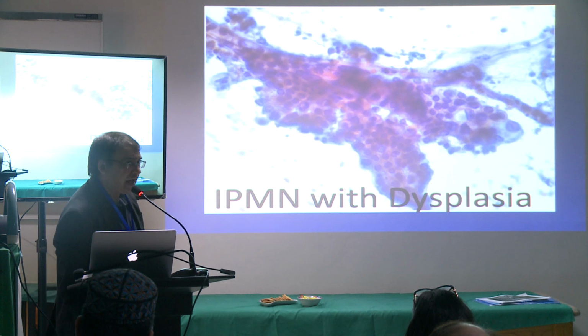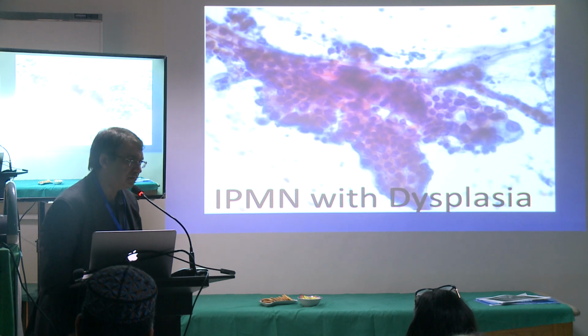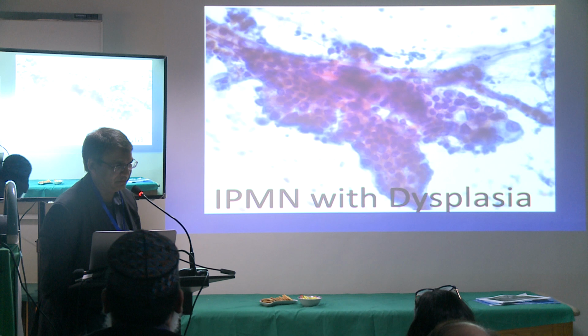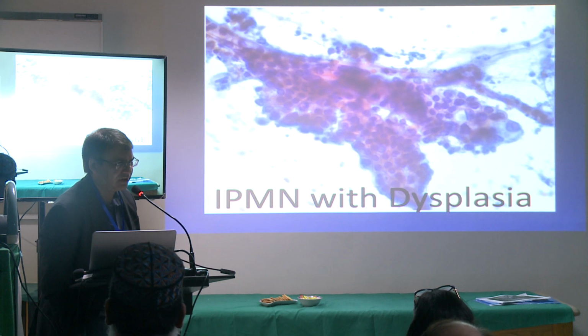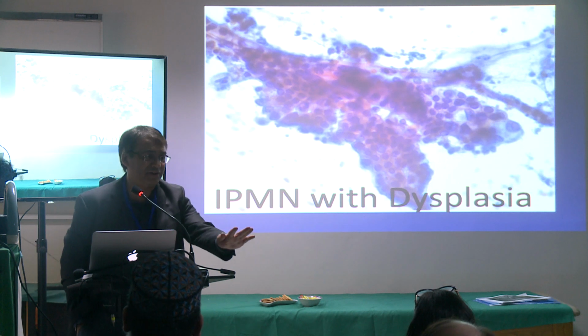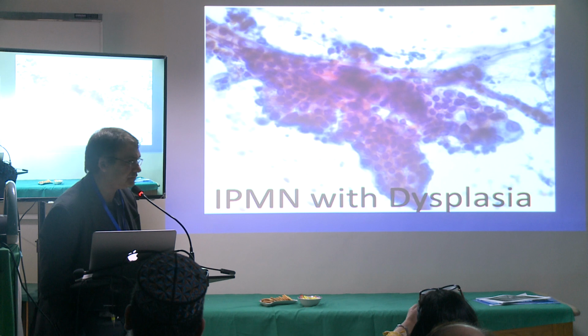Would that change your management now, or are you still sticking with your management? Surgical? Why do you say that? Why not IPMN? It's just a dysplasia, 3 months. You think it's going to be problematic in the future? You may be right, okay, but I'm asking for the reason.